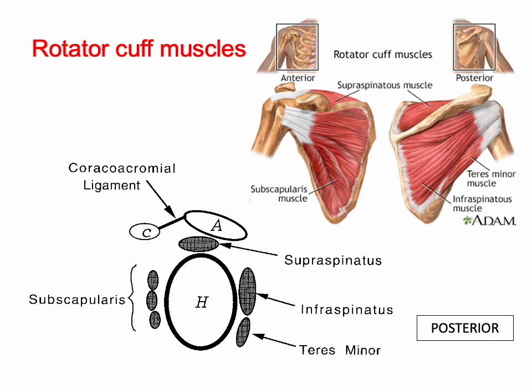So this is a sagittal view of the humerus, with the subscapularis anteriorly, infraspinatus and teres minor posteriorly, and supraspinatus superiorly. The relation of the supraspinatus, the acromion, and the coracoacromial ligament is important when looking at supraspinatus pathology, impingement, and bursitis.